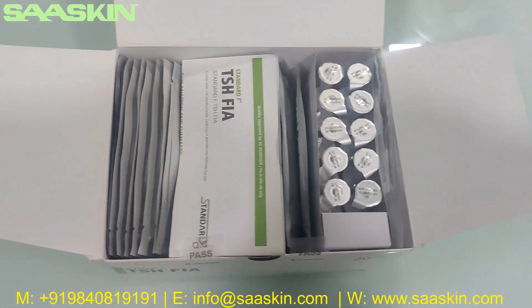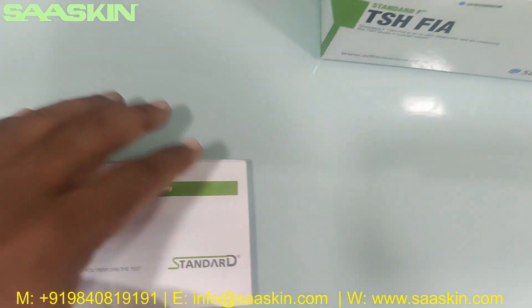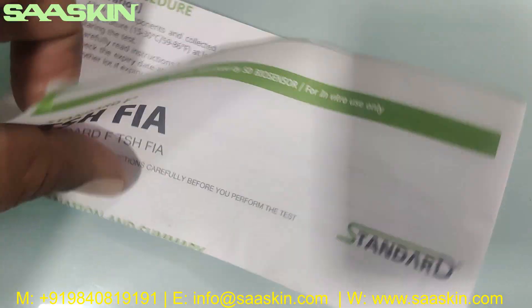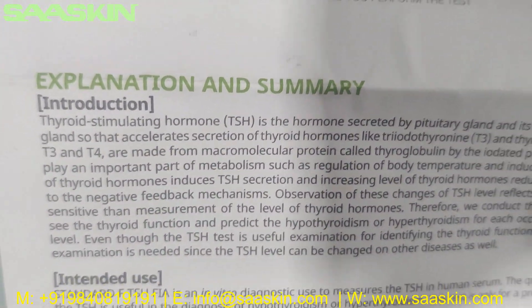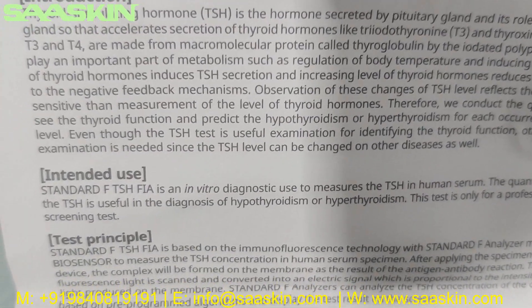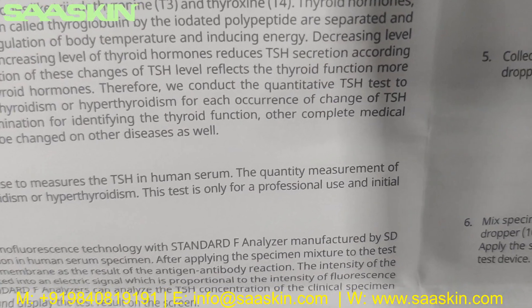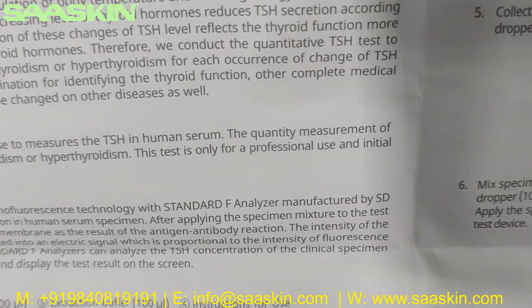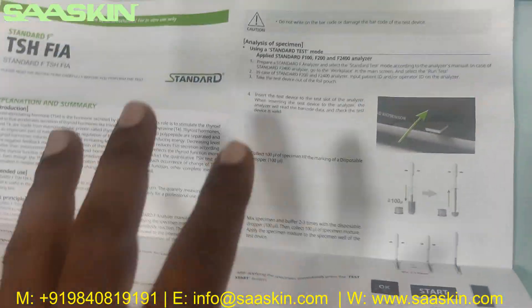This is how the inside of the box looks like. Inside the box there is one instruction for use manual — it says STANDARD-F TSH FIAT. This has the complete instructions and details to complete the test process. It covers Thyroid Stimulating Hormone testing: STANDARD-F TSH FIAT is an in vitro diagnostic used to measure TSH in human serum, and the quantitative measurement of TSH is useful in the diagnosis of hypothyroidism or hyperthyroidism. The test is only for professional use as an initial screening test. This brochure gives complete details about the kit, how to prepare the test, how to conduct the test, and how to interpret the results.